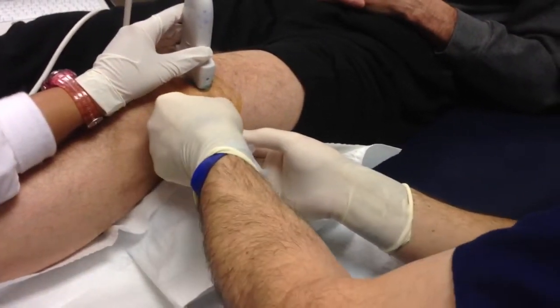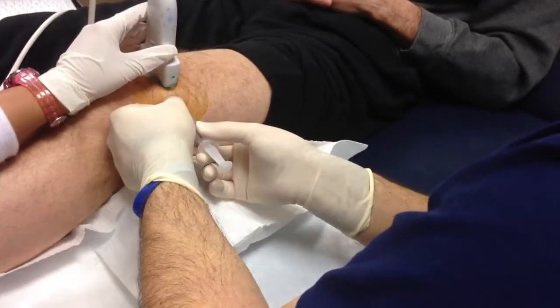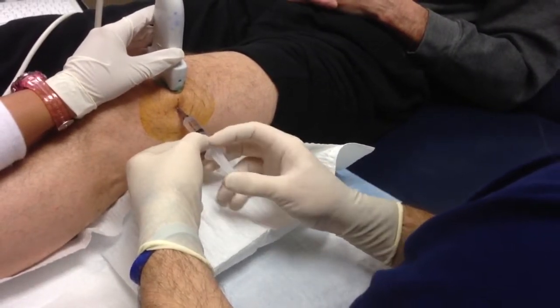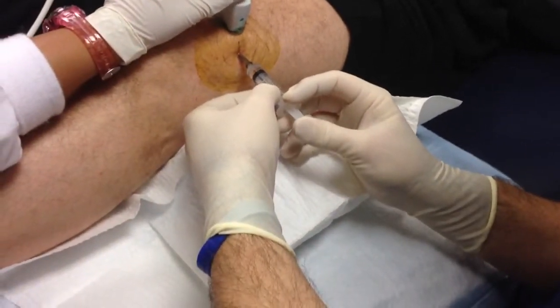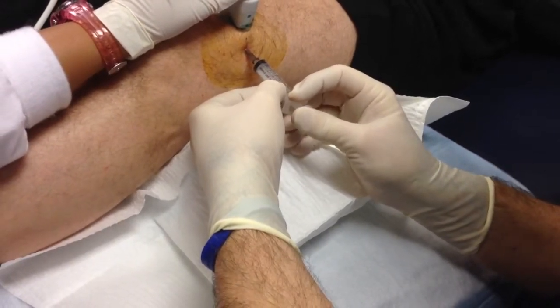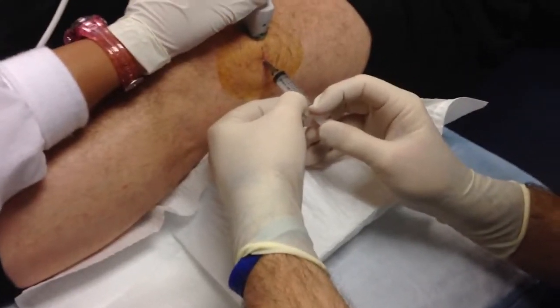This is really a nice picture, and I really appreciate our patient volunteering to be videoed. Now I just switched the syringe to the visco supplement — two cc's with one cc of local anesthetic. A lot of times you can kind of see a swirl in there, and you can see a little bit of that. Now I'm going to pull the needle out.